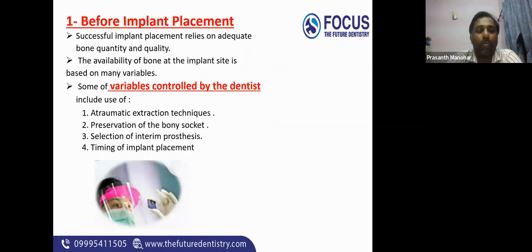So, before implant placement, we have to ensure that there is sufficient bone quantity and quality. Now, if any extraction has to be done, it should be an atraumatic extraction. We have to follow socket preservation procedures. An interim prosthesis has to be selected so that there is no movement of the adjacent tooth into the edentulous area. Then we'll have to place the implant.